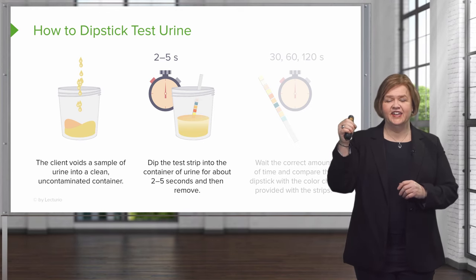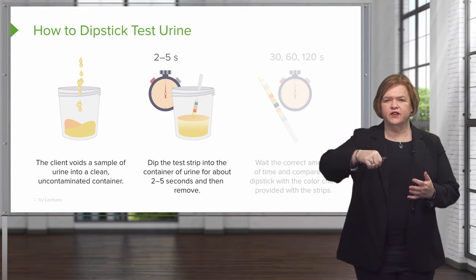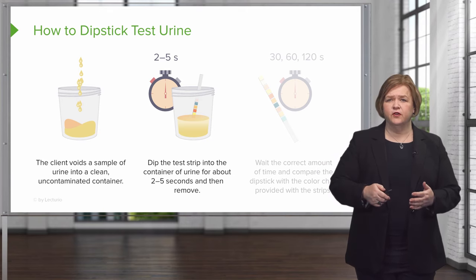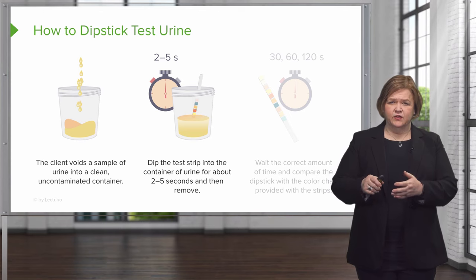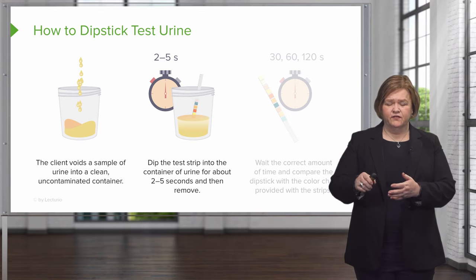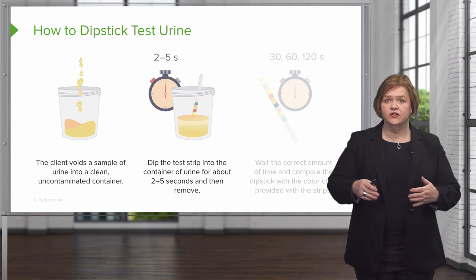So don't just quickly put it right in — put it in and make sure it gets well saturated. You should be able to do that within about two to five seconds. Then you're going to remove the strip from the sample. Usually we have a paper towel there to dab the strip off in case you have any drips. Make sure you keep your area clean and uncontaminated.